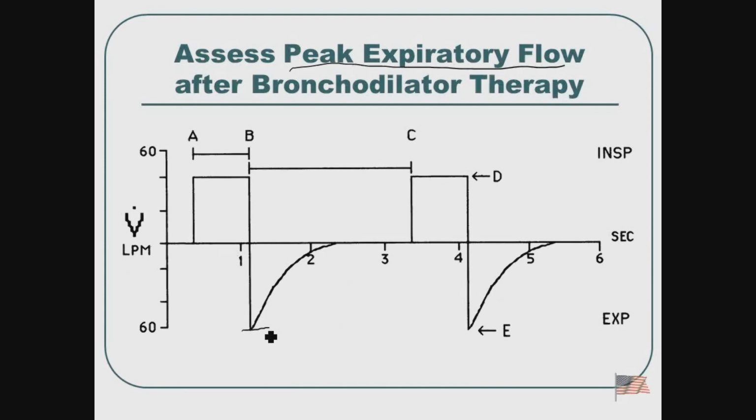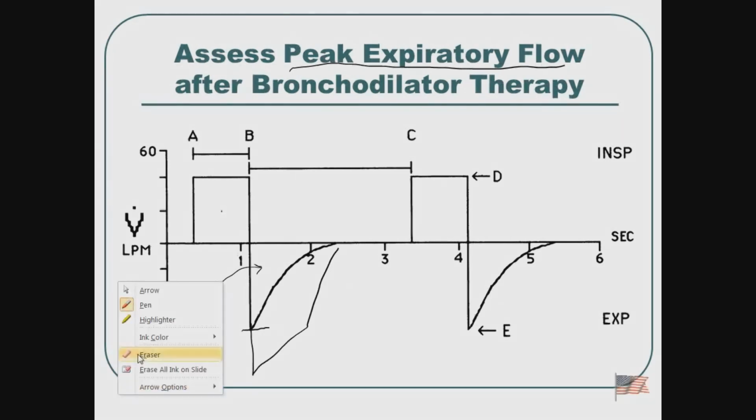As the patient exhales, this expiratory phase is totally dependent upon the patient. The shape of this is totally dependent upon the patient. This we set in volume-based ventilation.